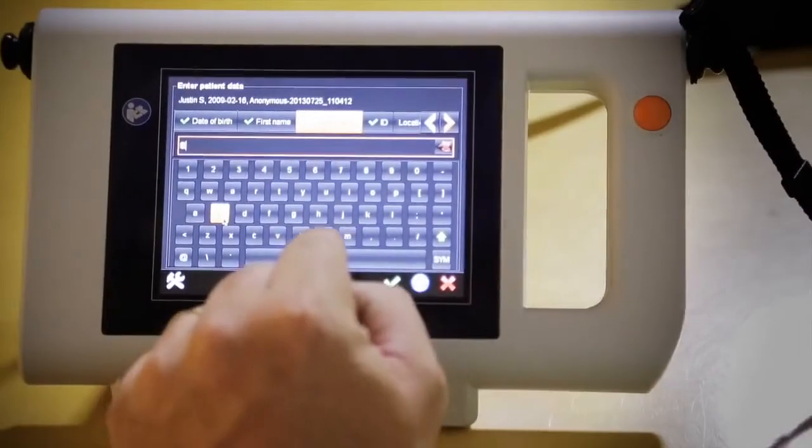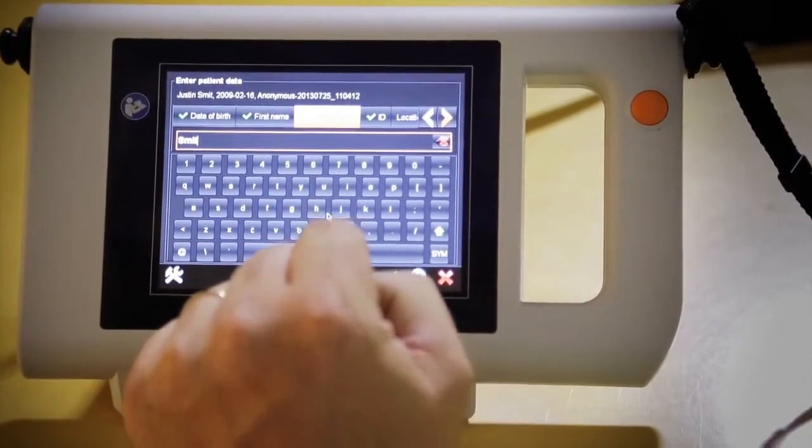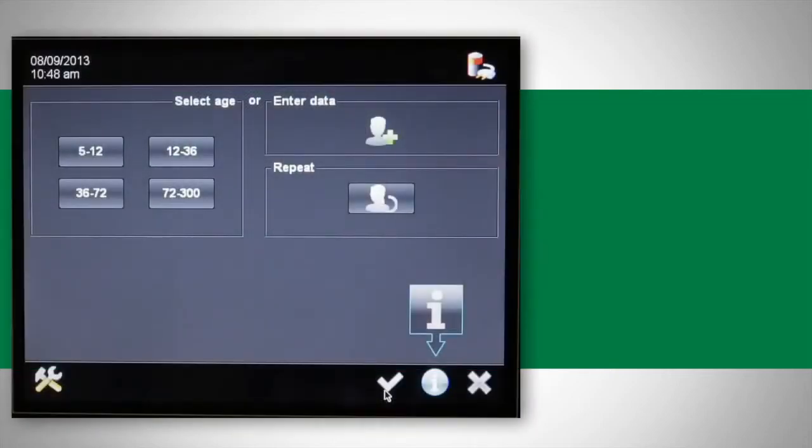You first need to either find the child's information on the device or enter it if the child is not in the database. If you would like to preload data into the device, please watch the video called "Importing Data."